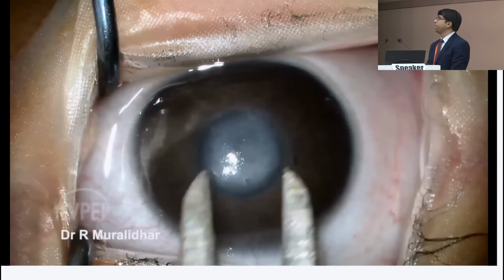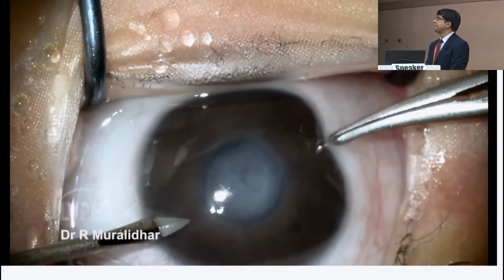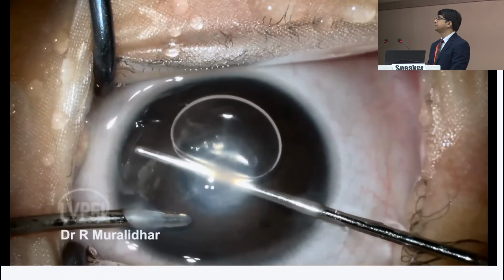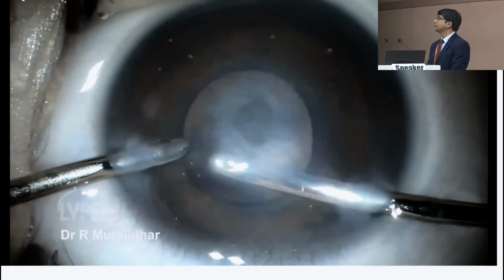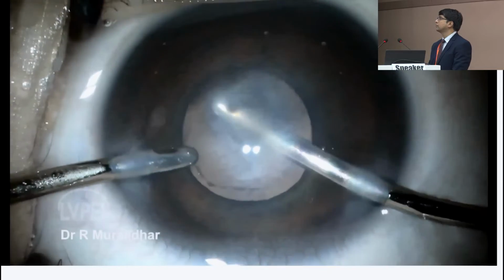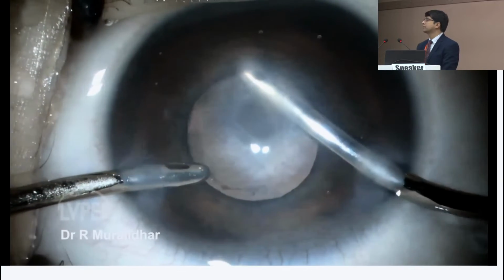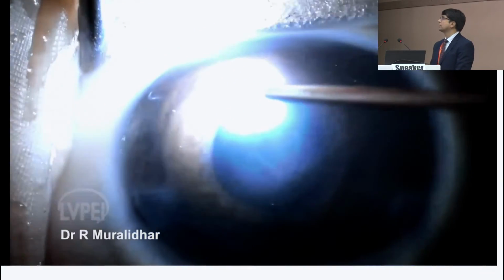This is a technique demonstrating selective endothelectomy. Step 1, severing the communication between iris and cornea. Step 2, identifying the actual defect. Third step, delicately removing the anomalous corneal endothelium without disturbing the integrity of Descemet's membrane. Step 4, checking the integrity of Descemet's membrane. There was no Descemet detachment at the end of surgery.